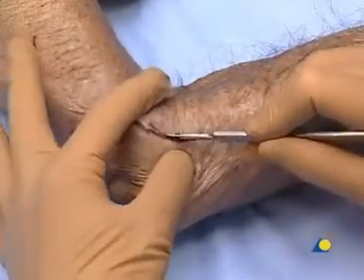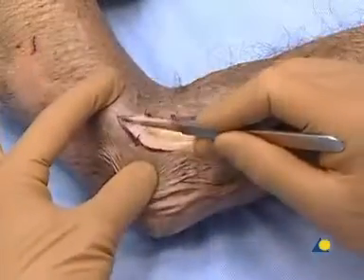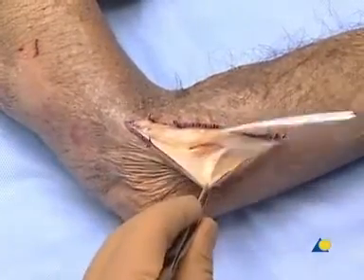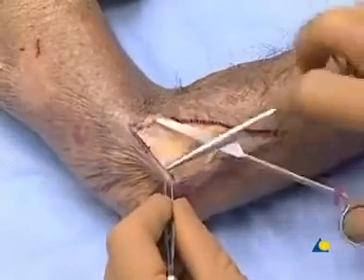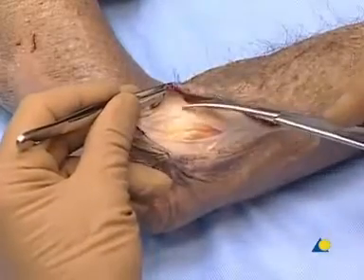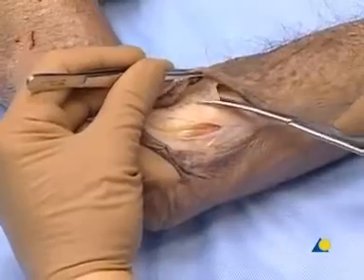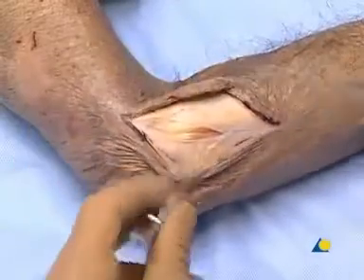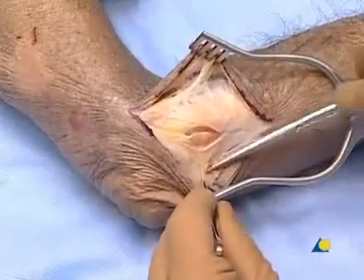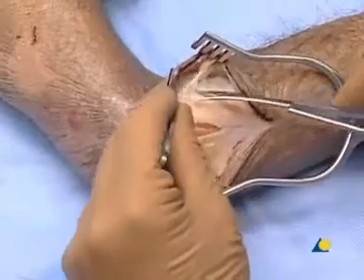The skin is incised. The extensor musculature should be visible in order to determine the location of the deep dissection. The tissue flaps are elevated. At this point, the extensor muscles should be visible.